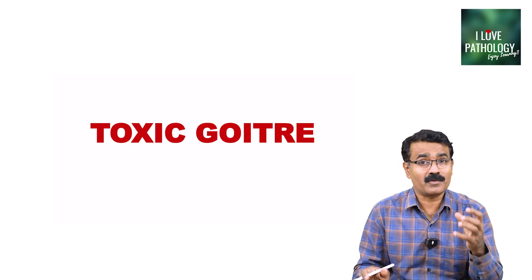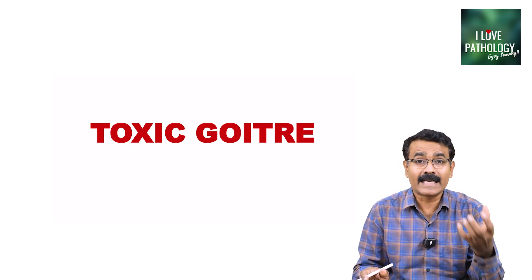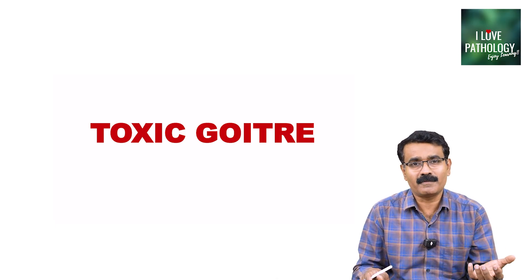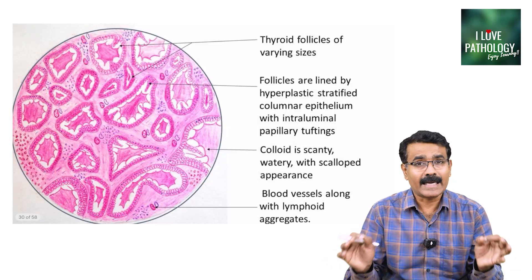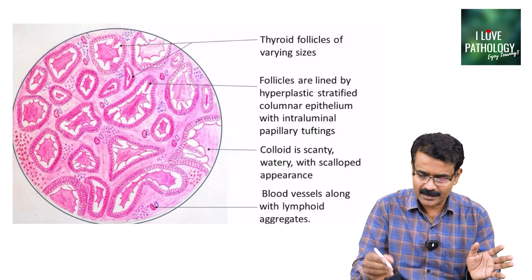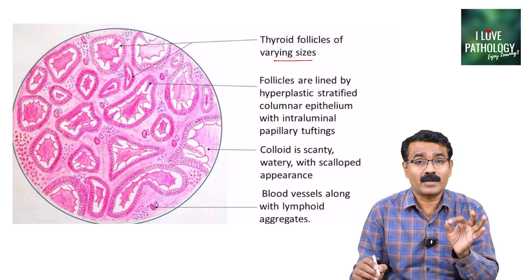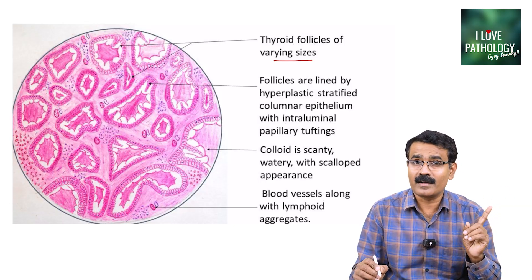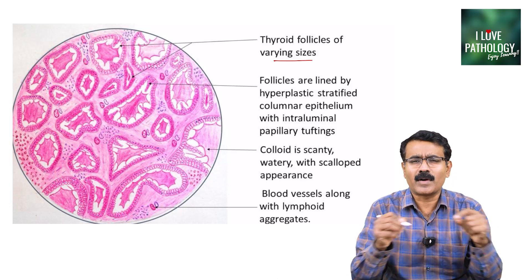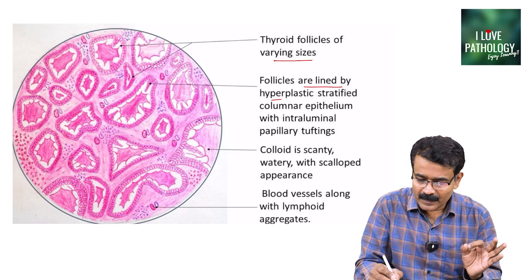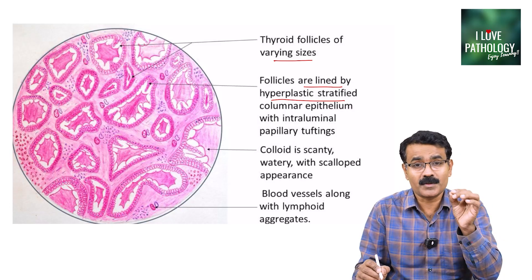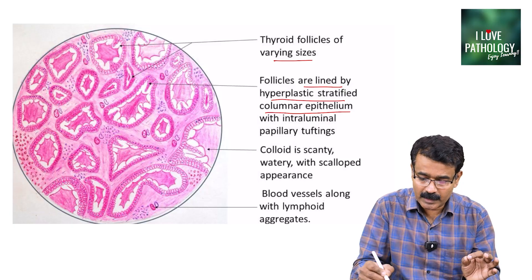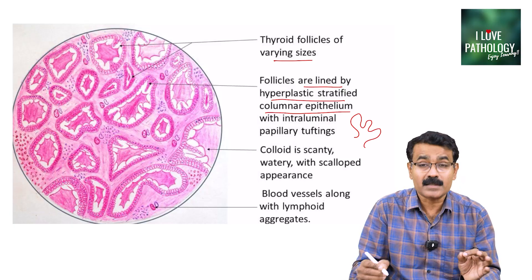Toxic goiter — as in Graves disease, which is an autoimmune disease — shows thyroid follicles of varying sizes. The most important difference from colloid goiter is that the follicles are lined by hyperplastic epithelium with increased cell layers — hyperplastic stratified columnar epithelium. Sometimes you can also find intraluminal papillary infoldings due to hyperplasia, with papillary tufting of the epithelium into the lumen.